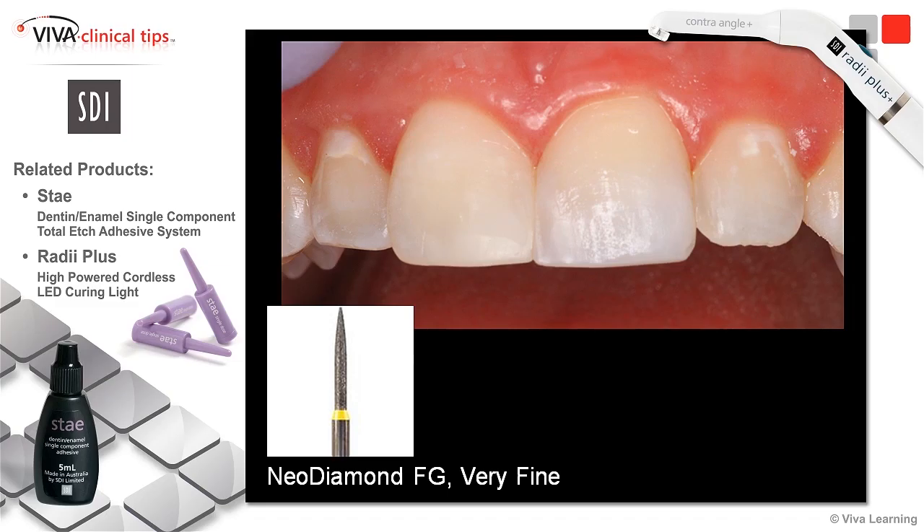Now you can see I've really taken everything off — my other strips are gone, any other isolation we're using. Here's my tooth, my bare tooth, ready to go ahead. I like to use Neodiamonds, I think they work very well. I use a very fine friction-gripped Neodiamond and go ahead and sculpt, start to place some of my anatomy and get my occlusion correct, as well as making sure I've got good rounded interproximal regions and everything's flossing really nice.